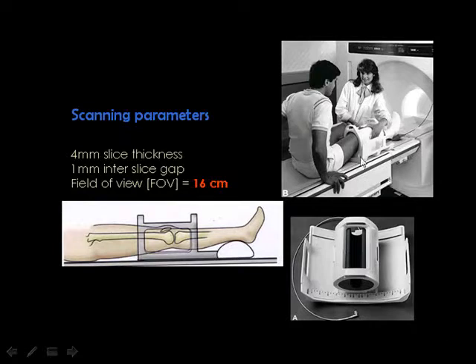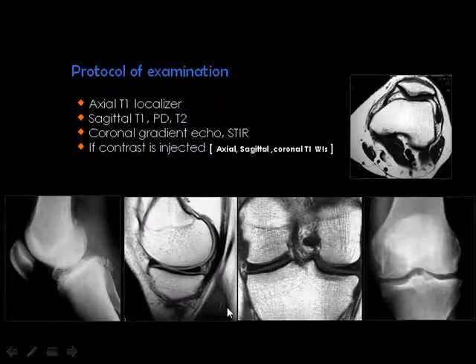And this is the way we can apply this surface coil. It can be opened, then you put the knee, then you close the coil, and you put some fixators beside the knee. This coil is connected to the main machine by this wire, so that you can produce the images and collect the images on the film. Then, if you look at the MR of the knee, you can see sagittal images and coronal images, as well as axial images. All the kinds of images we can have.